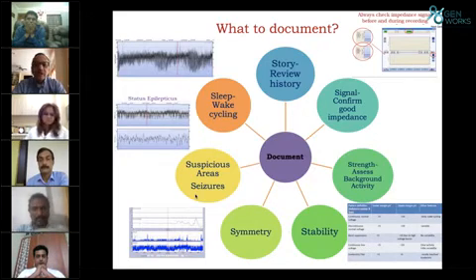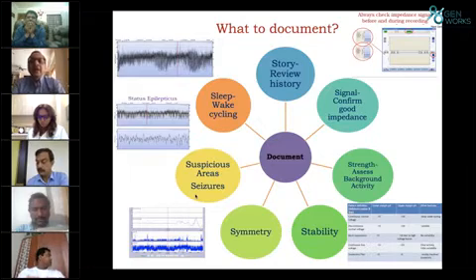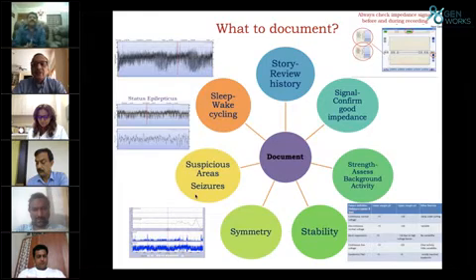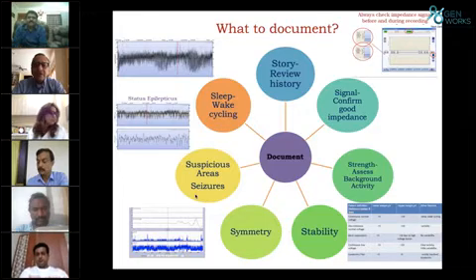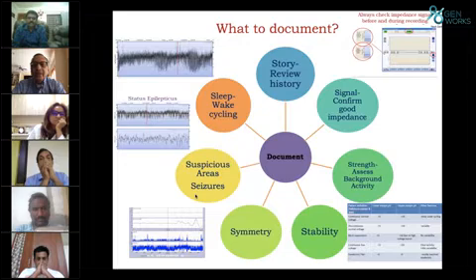So this is a 3-day-old with hypoxic ischemic encephalopathy, or a preterm baby at a certain gestational age, and what is going on in terms of an overnight event. It's important that when you review amplitude integrated EEG or any EEG, you review the signal quality. So S for signal. We need to make sure our impedance is below the 10 or 20 kilohm mark, so that we can reliably interpret the signal.